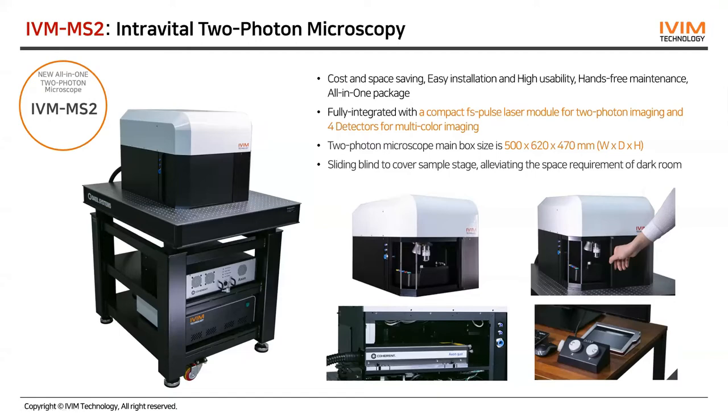Okay, so I've done intravital imaging in the past where if you do a very short high dose of laser, it would normally kill a cell and then the other cells migrate in around it. That's possible. Yeah, but for that purpose, we need a different model of laser. Actually, we need a higher power model. In this case, this laser model can deliver up to a couple of 100 milliwatts, so that may not be enough. Okay, so let me rephrase it.